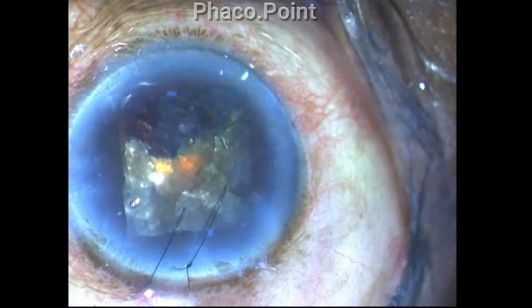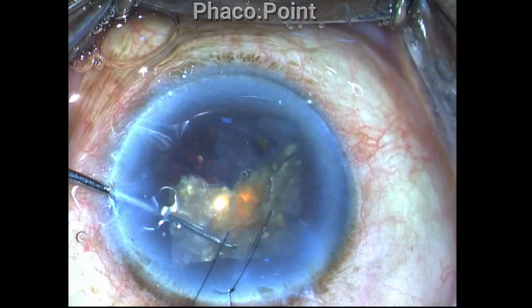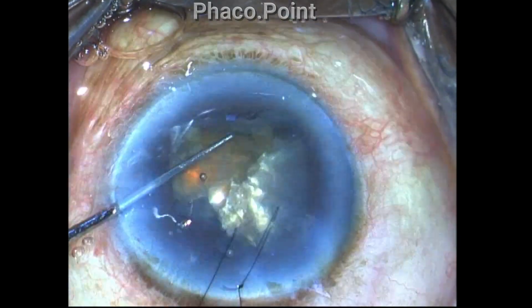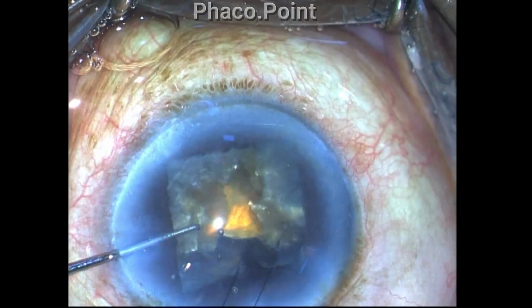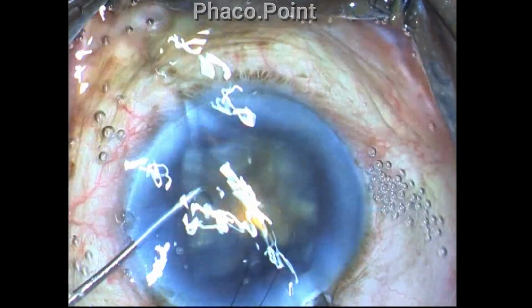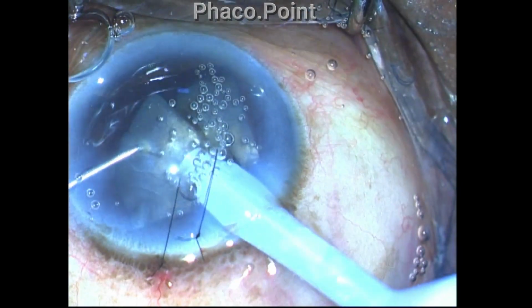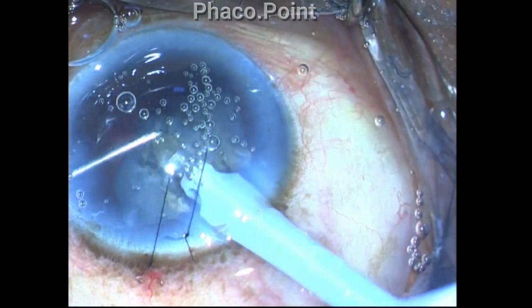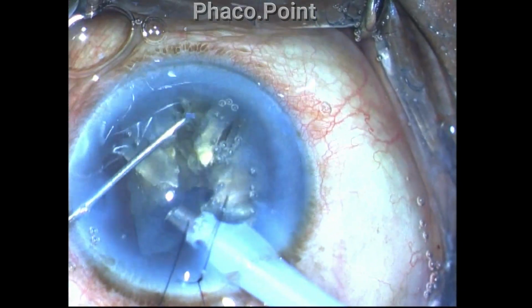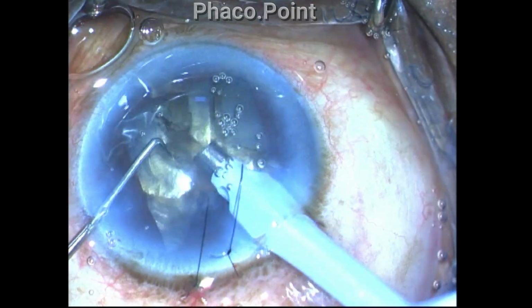So to protect the endothelium, I push in further viscoelastic to not only reform the chamber but also to protect the endothelium. I take this interlude to rotate the nuclear pieces to a comfortable inferior position, and then I continue with phaco emulsification. Of course, I should have gone in without the flow, which would have been better if there is a Descemet membrane detachment. What I noticed is these 2 restraining sutures that I had applied are doing a pretty good job of keeping the Descemet membrane attached.